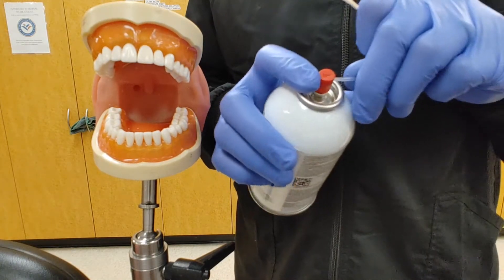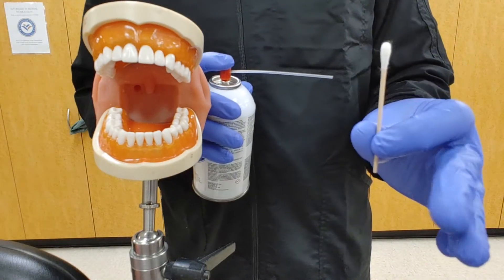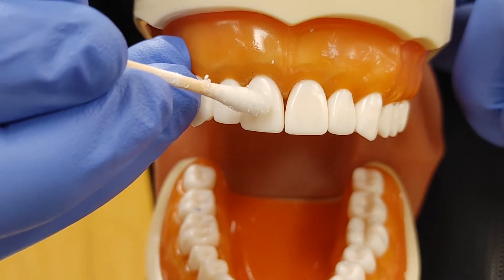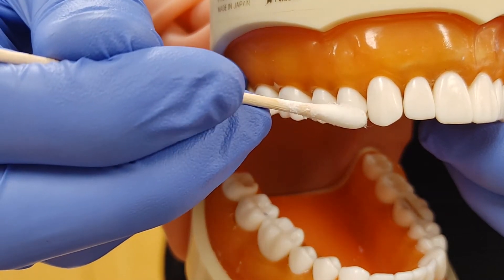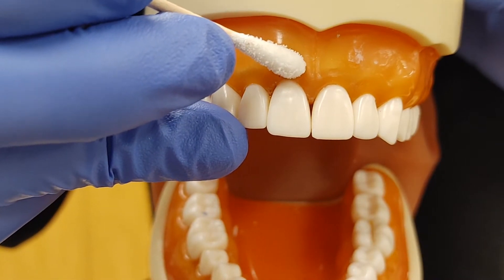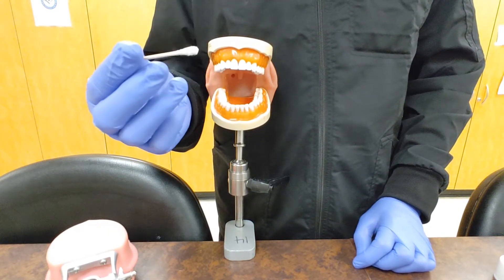Go ahead and affix the straw straight to the nozzle and plan on spraying either away from the patient or behind the patient so they don't get hit with any of the chill. Give a two to three second spray directly on the tip of the cotton tip applicator after you shake it. When placing on the tooth, place it on the direct center of the buccal or facial side of that tooth. Check a couple of neighboring teeth next to it and also the teeth across the way. Be wary to keep the chill stick off of the gums to not elicit a wrongful response.